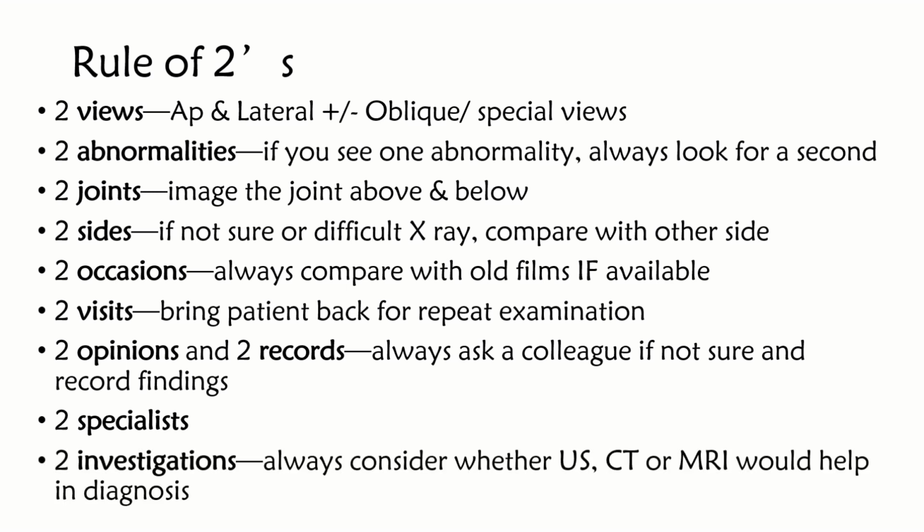Then two investigations. Nowadays, in addition to X-rays, many times we seek the help of a CT scan. For example, in spine fractures, pelvis fractures, and periarticular fractures. Sometimes we also make use of ultrasound and MRI to aid in our diagnosis. So these are the rule of twos.